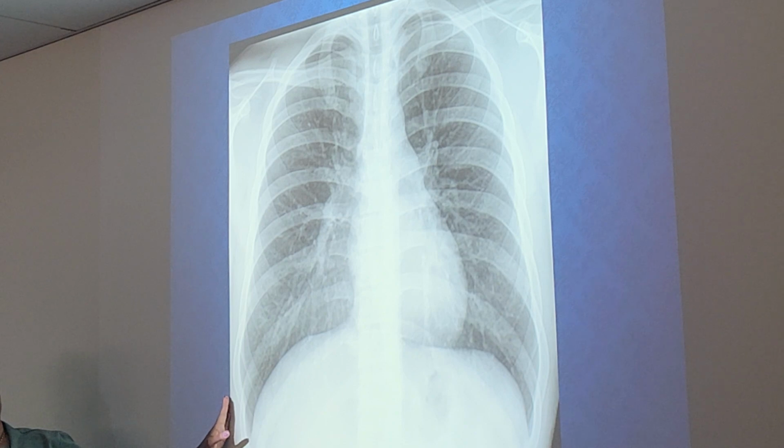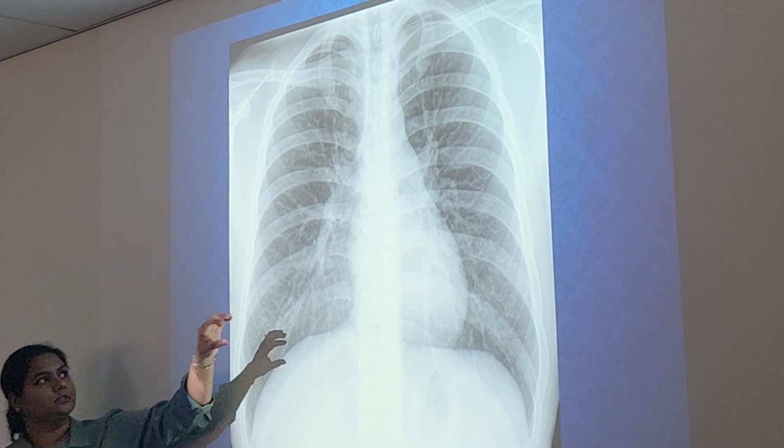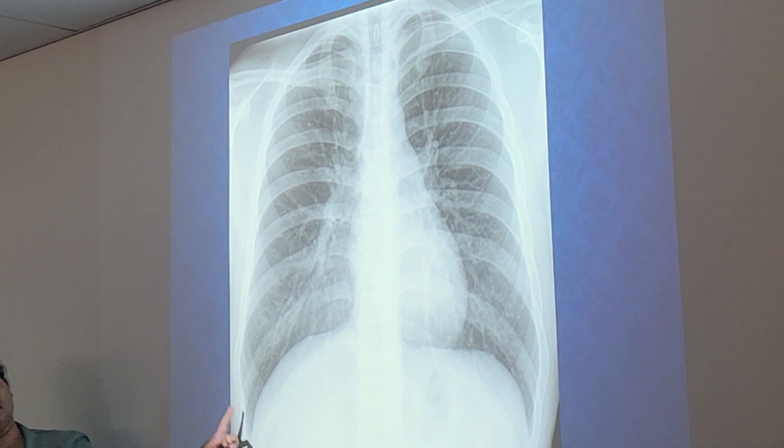No, AP is more horizontal. If the patient was in an AP position, with the X-ray tube facing me, the ribs will be more horizontal. On this one, it's coming down like this. So this is PA. But like I said, I don't like the ribs situation.